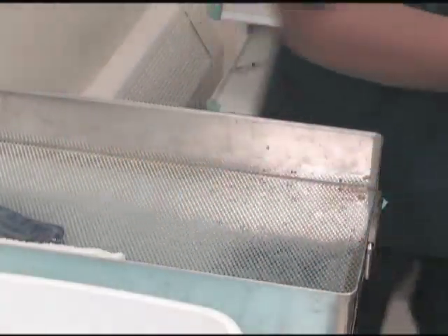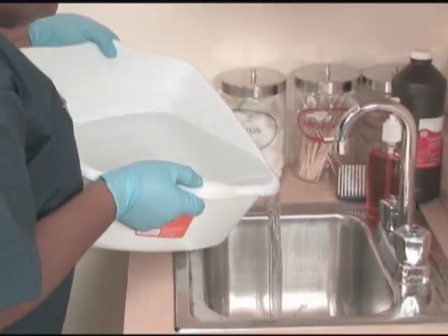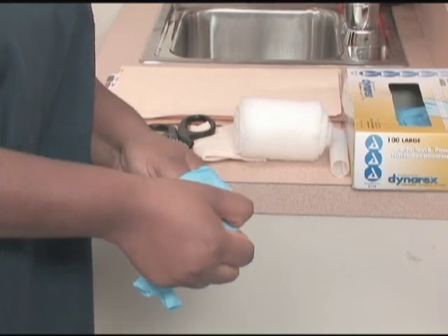When the cast is complete, clean up the workstation. Remove your gloves and wash your hands.